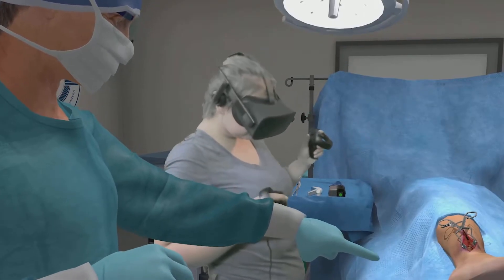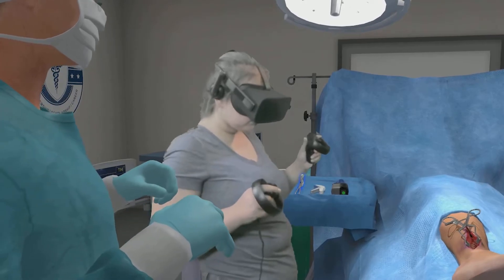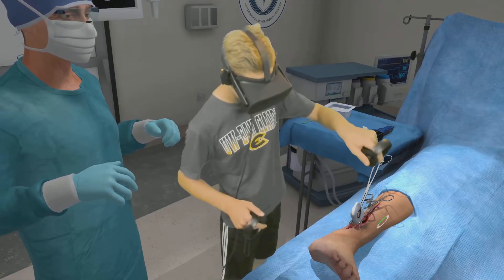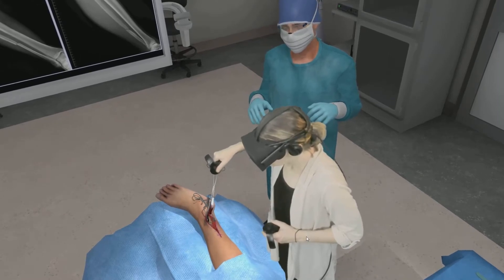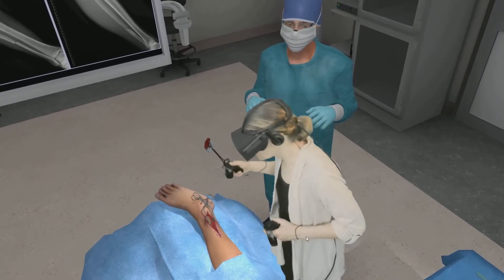It looks like we will need to remove the blood and clots to better visualize the fracture. You can now see the bone and fracture clearly.